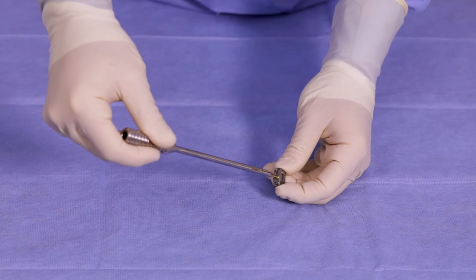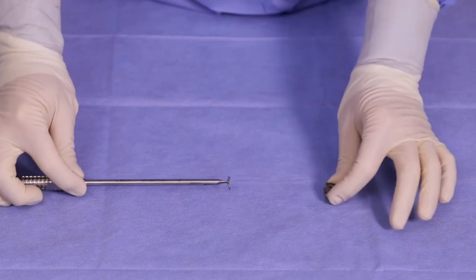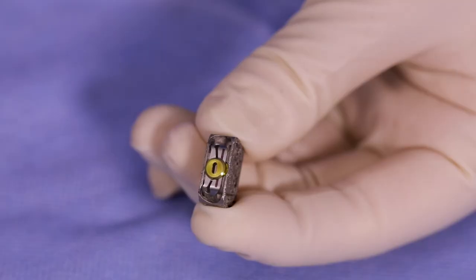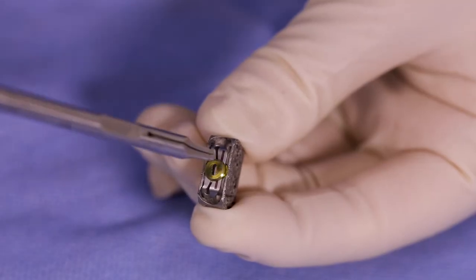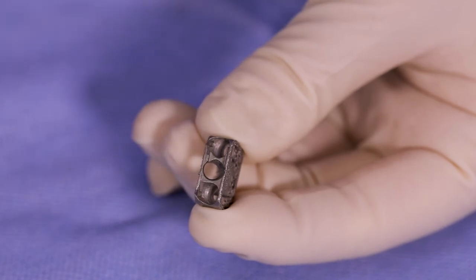The construct is now fully assembled. If removal of the construct is required, remove the cover plate assembly with the tapered straight cover plate driver by rotating counterclockwise until the click can be felt and the laser line indicates the cover plate is unlocked.